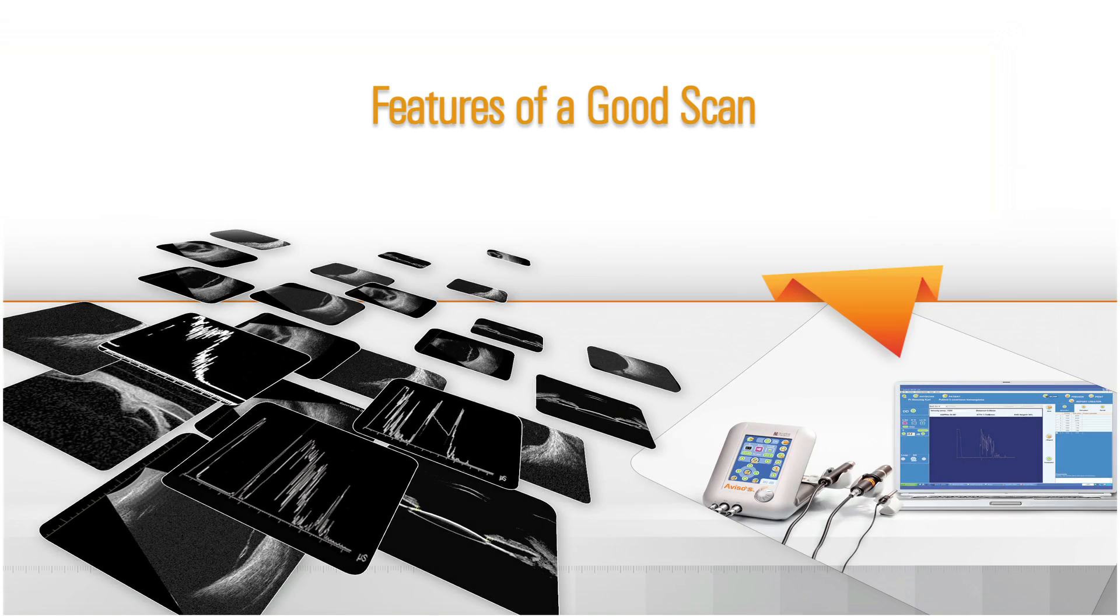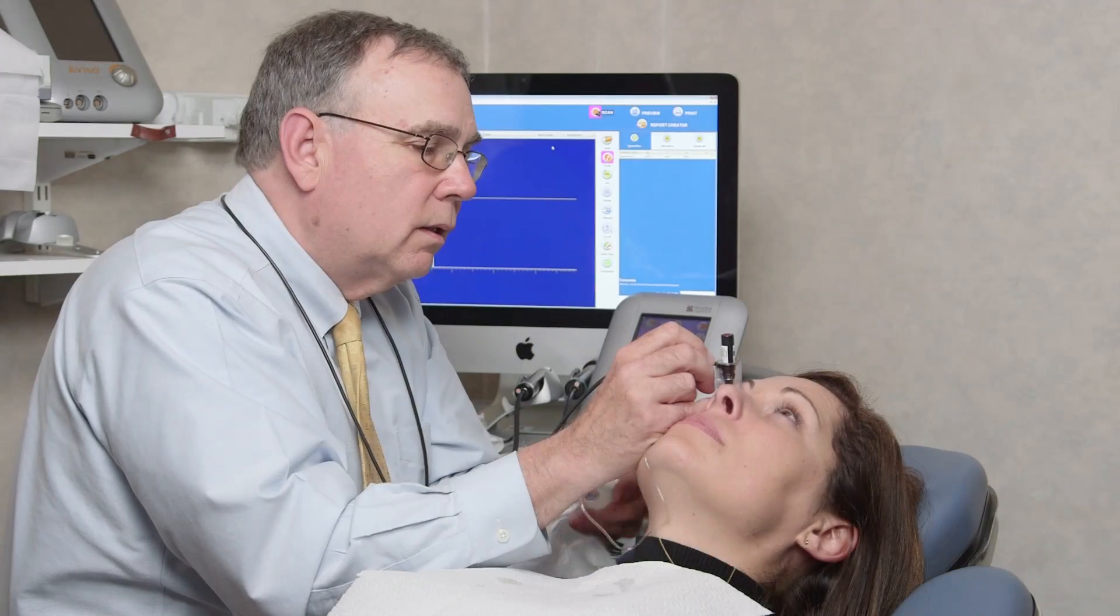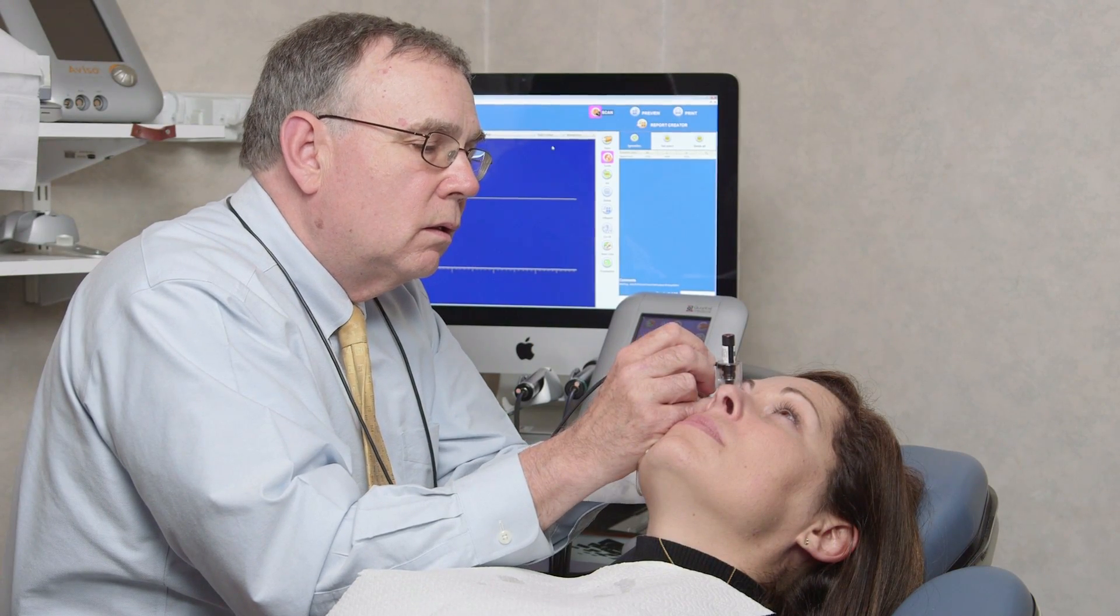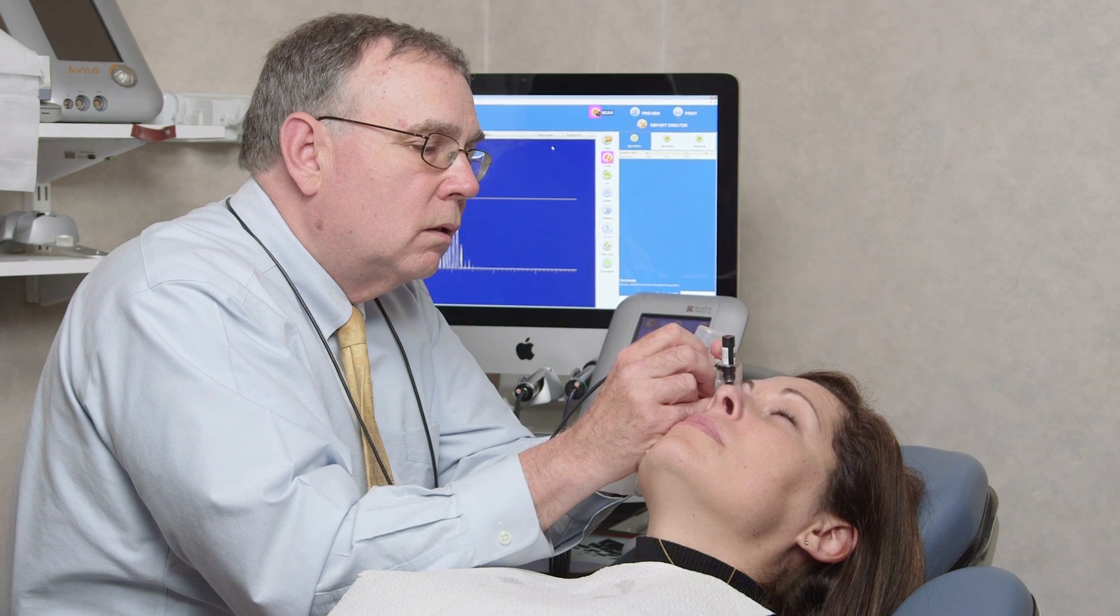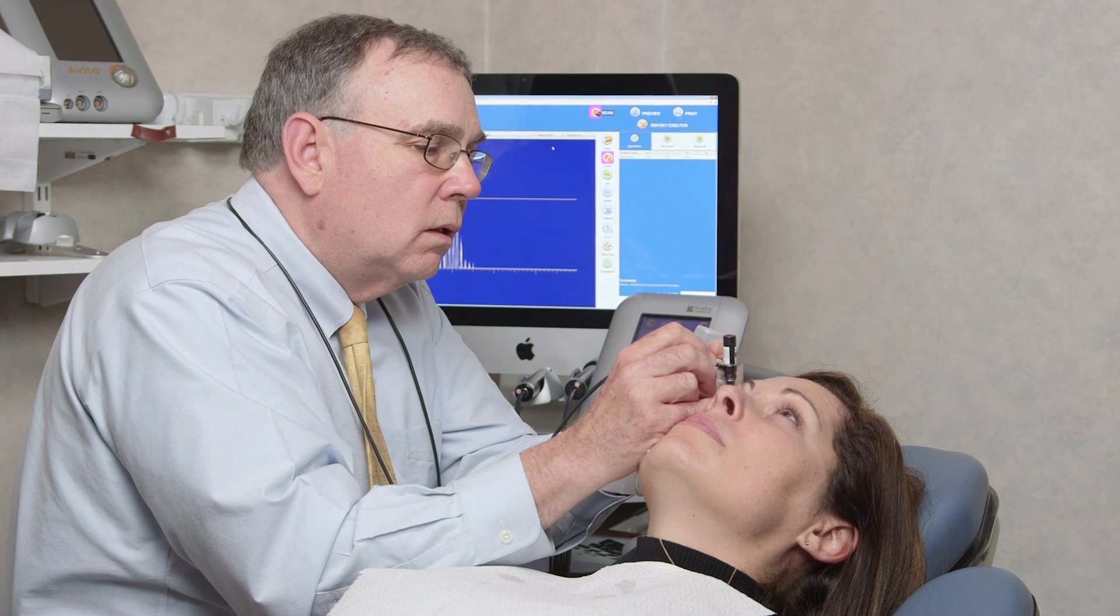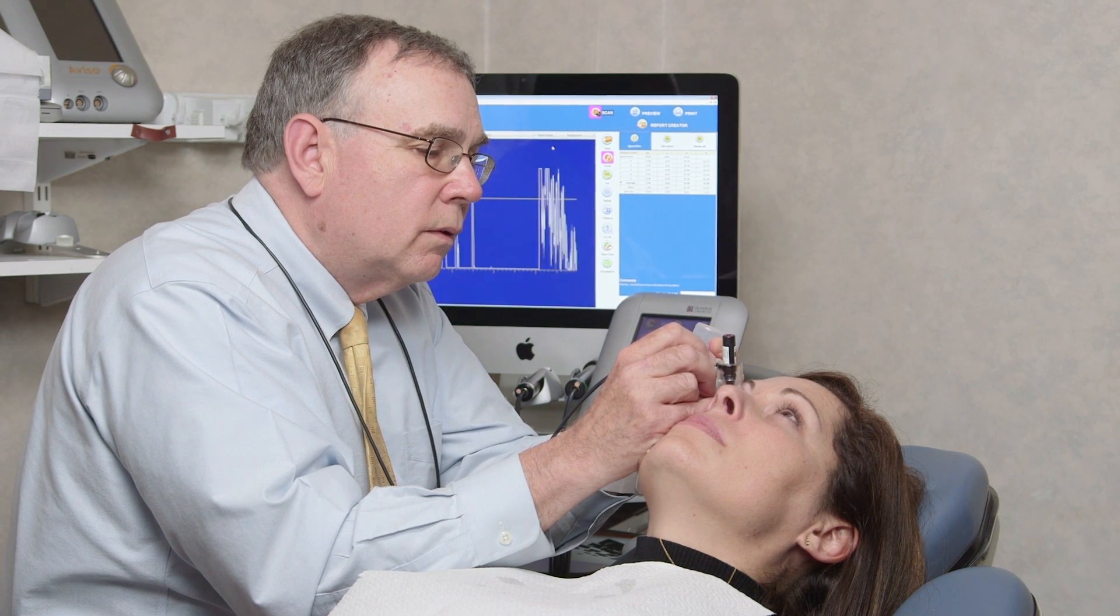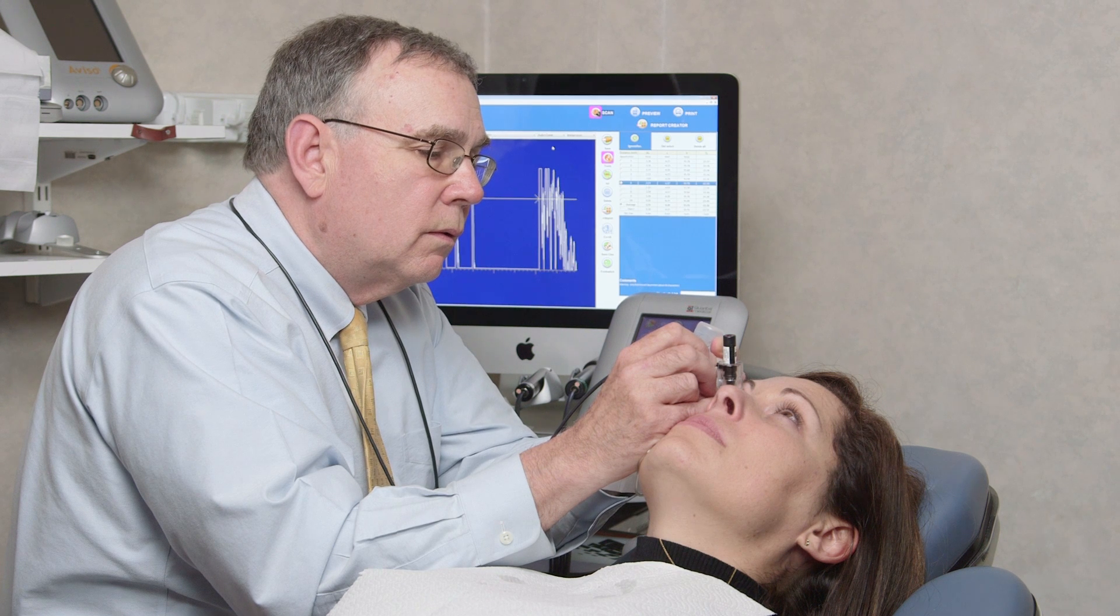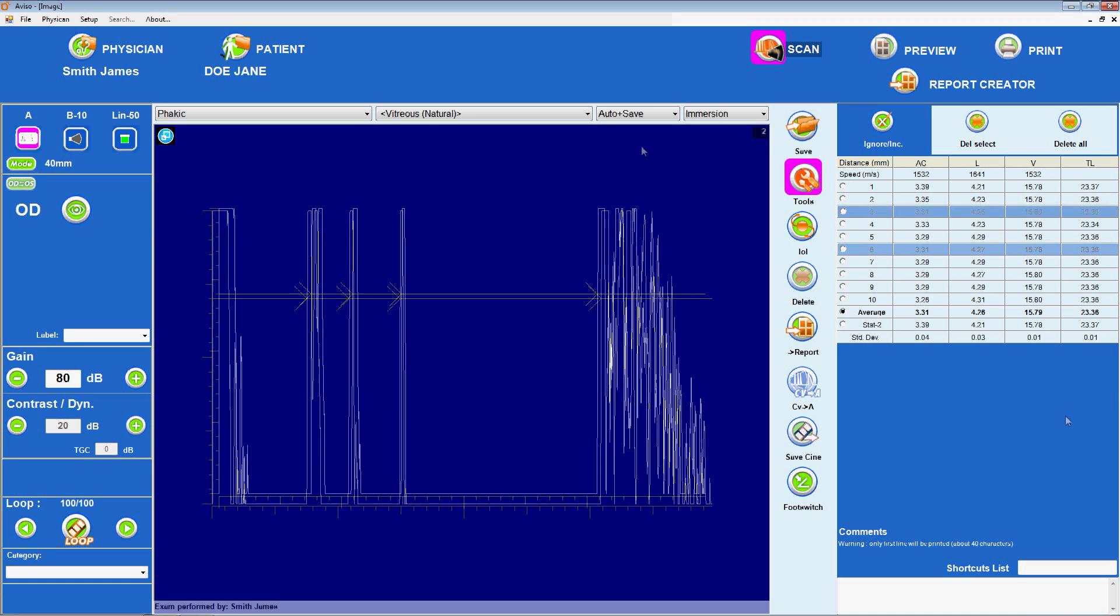Features of a good scan. IOL power calculations should be based upon the best scans obtained, and suboptimal scans should be discarded. So the examiner must know the features of a good scan. A good scan is characterized by steeply rising, high amplitude peaks, corresponding with the cornea, the anterior and posterior surfaces of the lens, the retina, and the sclera.